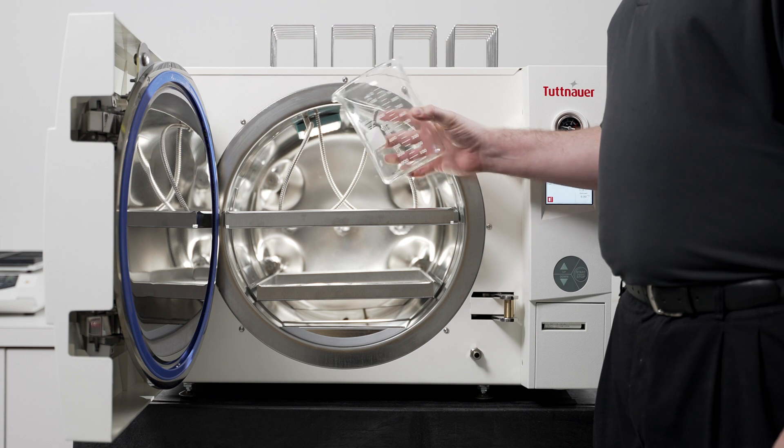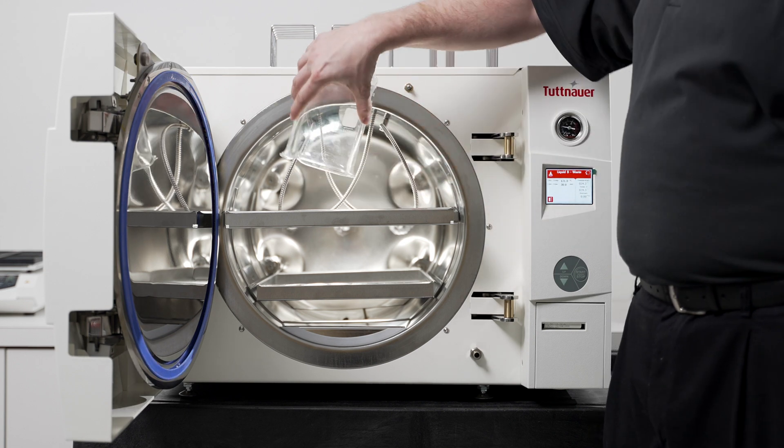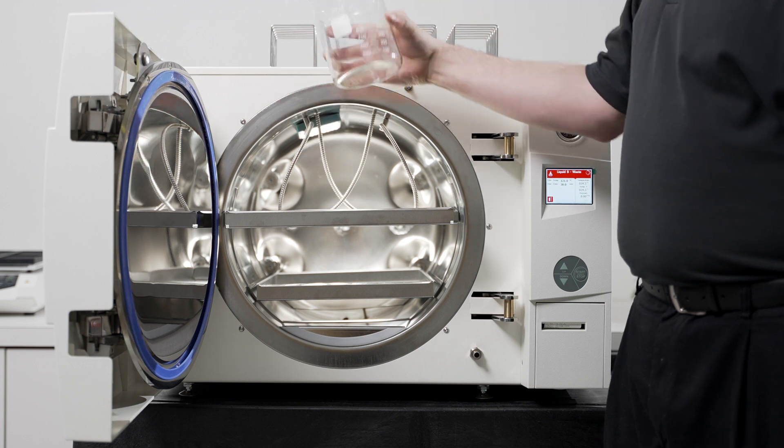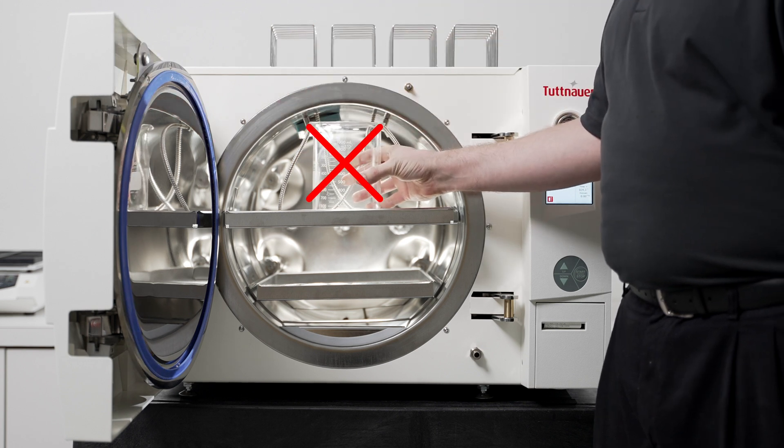When loading empty vessels, be sure to place them on their side or upside down on the perforated tray to allow for proper heat penetration. Placing them upright could cause cold air to become trapped inside.